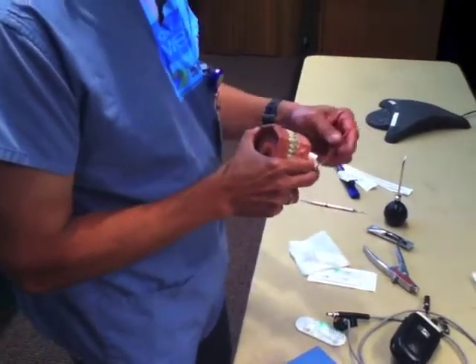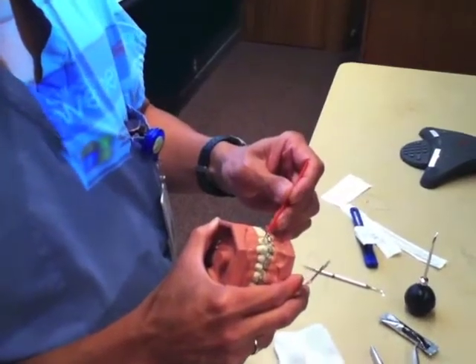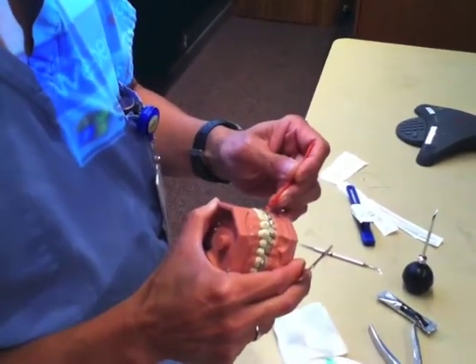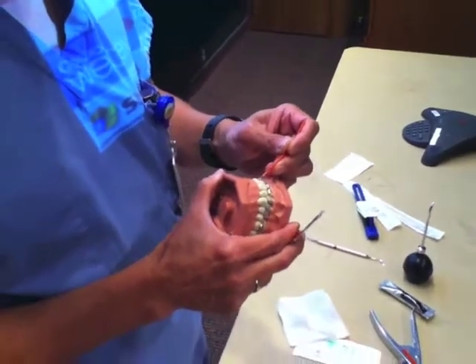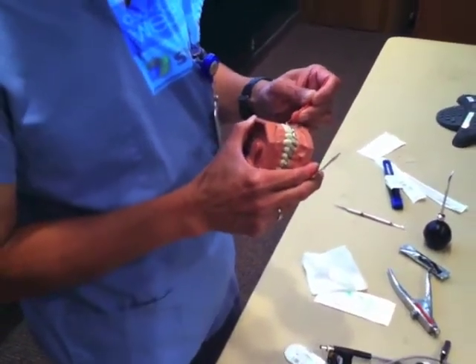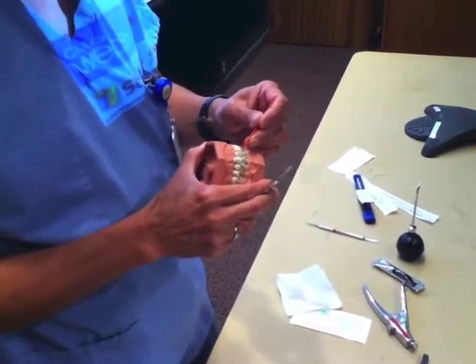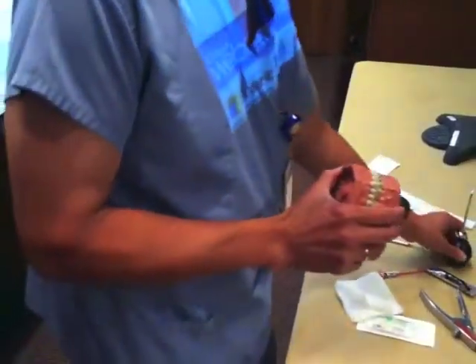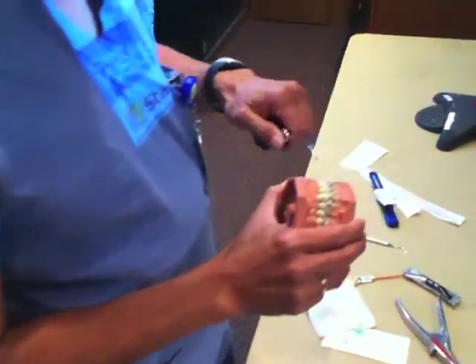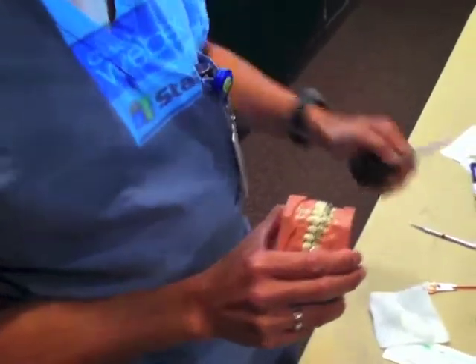After you've done that, swirl this around and paint this on — right where the white spots are. What you should see is the enamel will get frosty white. When you paint the bonding agent on, it'll look wet and the frosty white goes away. If you like, you can blow a little air on it just to thin it out a little bit. Simple as that.